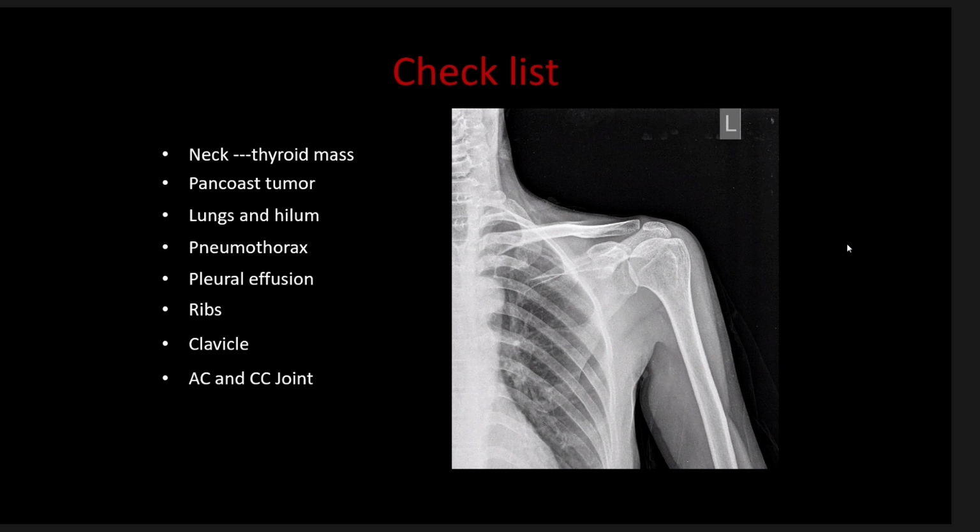The question is, apical pneumothorax on shoulder X-rays is a bit tricky in rapids. Any tips on that? Always look for a visceral pleural line. You have to train your eyes. Once your eyes are slightly trained to trace the visceral pleura and the avascular zone, what I would recommend, Shweta, is to just Google pneumothorax on chest X-ray, click on the images and try looking at at least 10 images per day. Gradually, you'll start picking up and your eyes will get trained to look for pneumothorax.